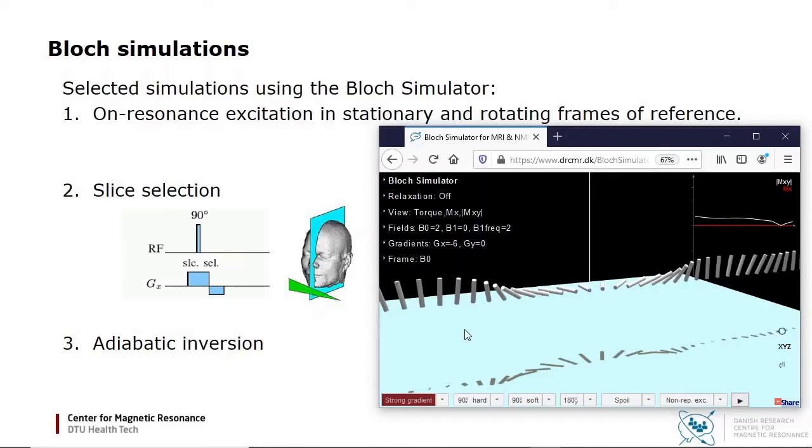Please note that we get little signal from the slice, however, since the directions vary between positions. We can remove the so-called phase roll, or phase ramp, by inverting the gradient briefly, as indicated in the sequence diagram.